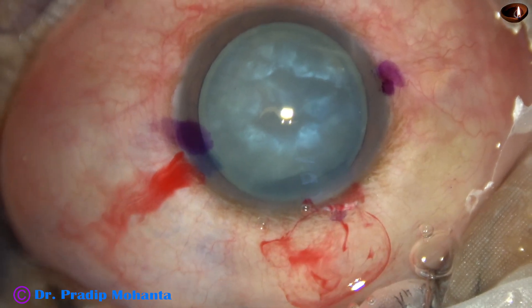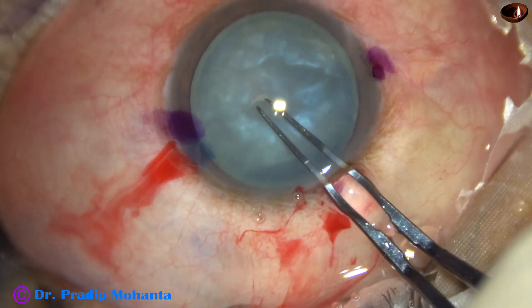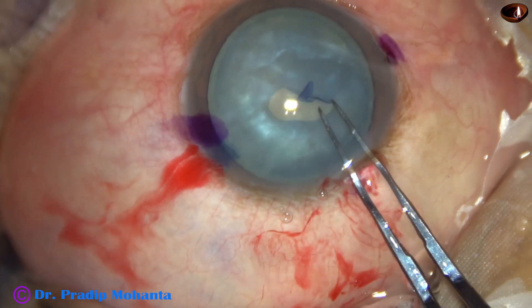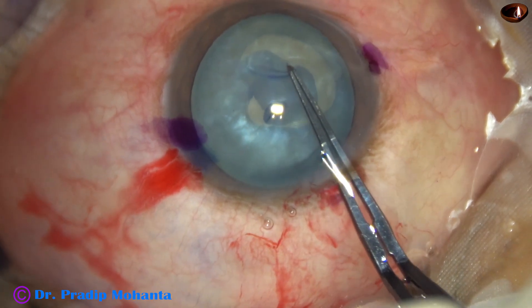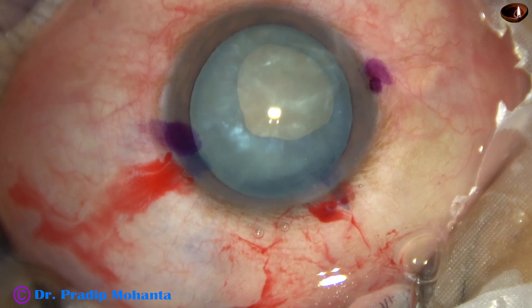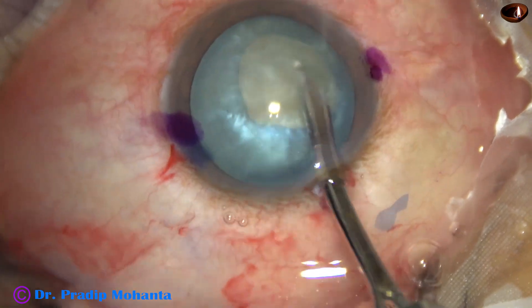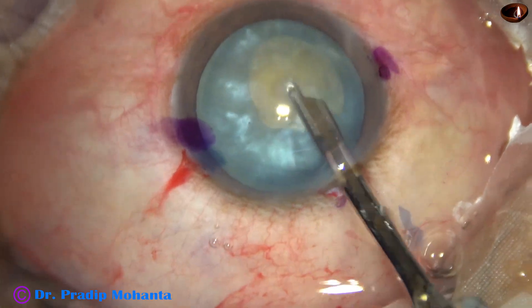Now I make a puncture on the anterior capsule, and as I try to do the rhexis, see what happens — the rhexis tends to go to the periphery. I use the quick pull technique and bring it back. But see the size and position of the mini-rhexis — it has become eccentric.